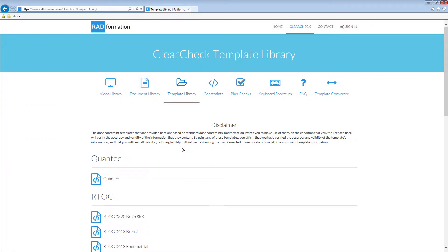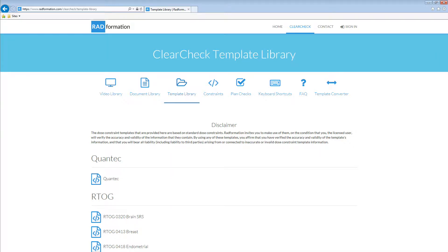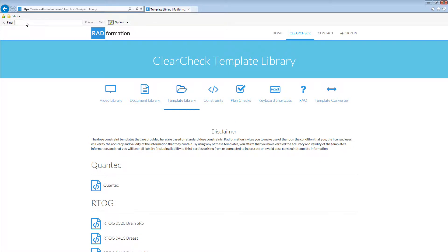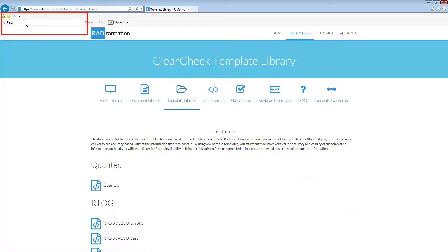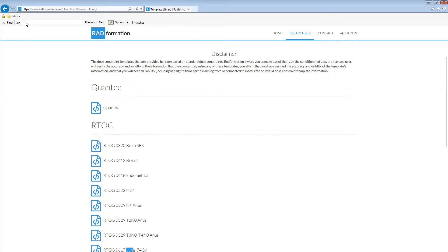This web page is a collection of constraint templates that Radformation has pre-configured for your convenience. To search for a specific constraint template, hit the keyboard shortcut Ctrl plus F. A search box should now show up. Depending on your web browser, the location of this search box may change. Now you can type the name of the constraint template you are looking for.